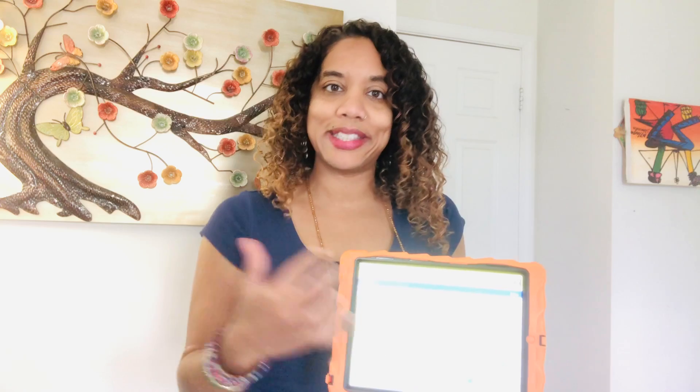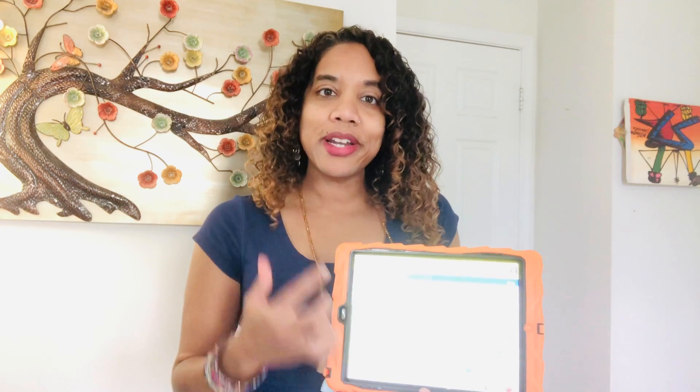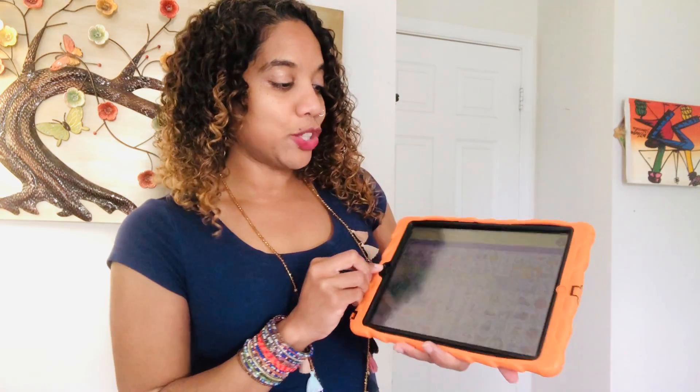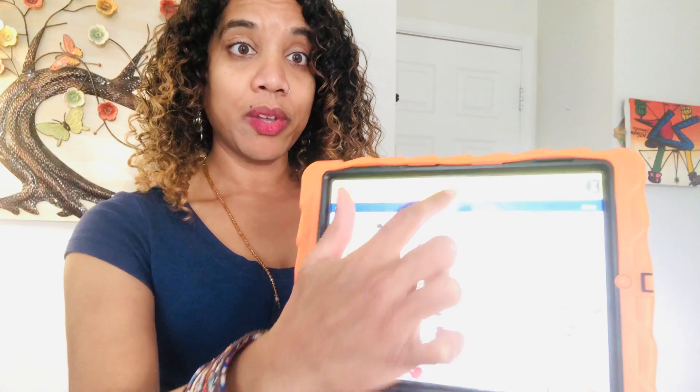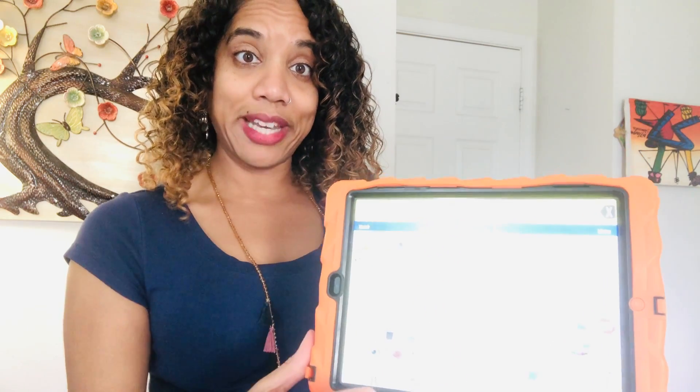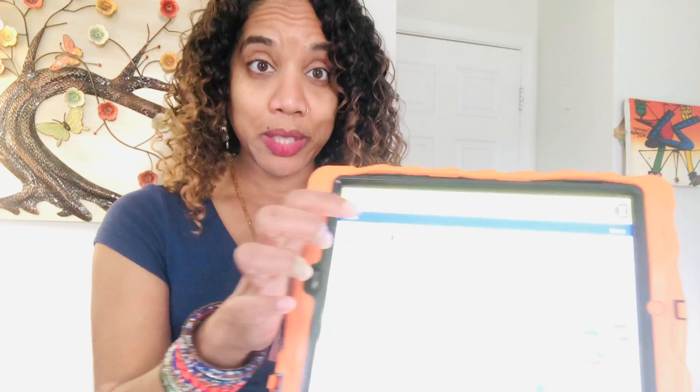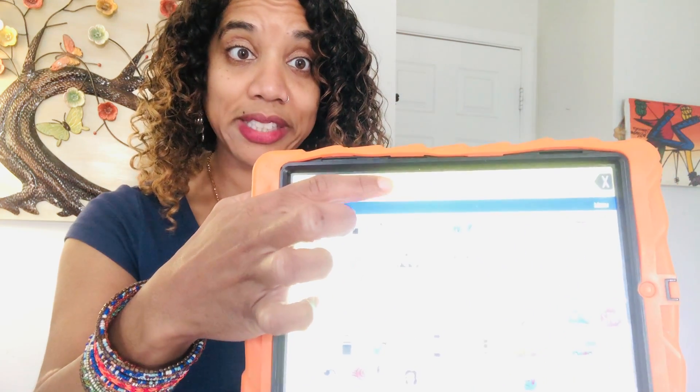Step two, which I'm sure you've been working on the whole time, is their message. One key thing to remember is when they're putting their message in, you want to make sure they also take the time to touch the top bar that says the entire statement. So if they've been putting in 'I want more,' you want them to, once they have someone's attention, press 'I want more,' so that they are getting attention and then pressing the bar that has their entire message.